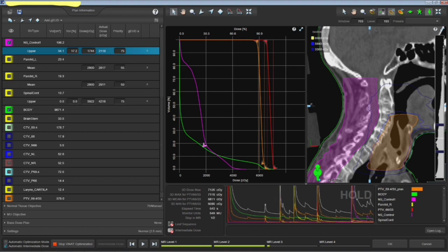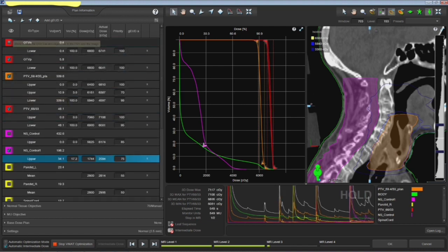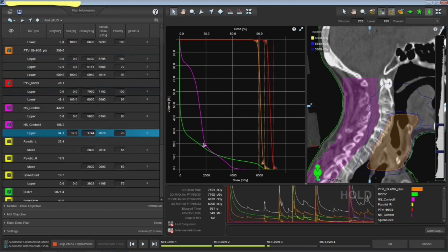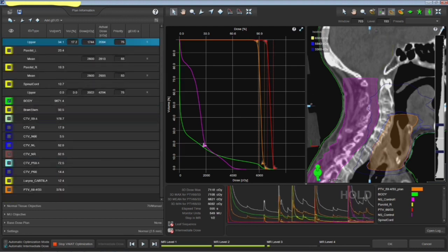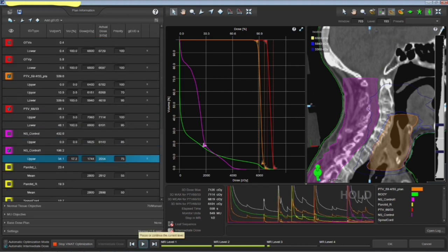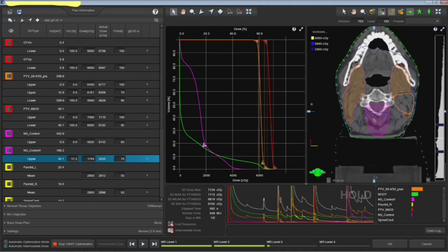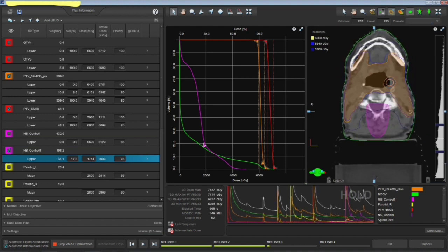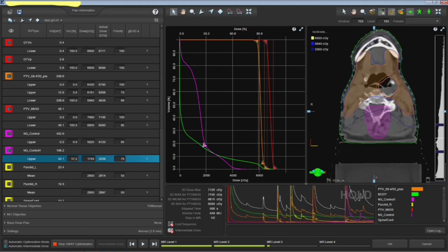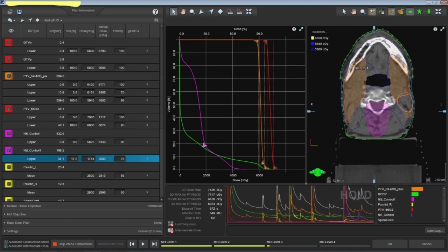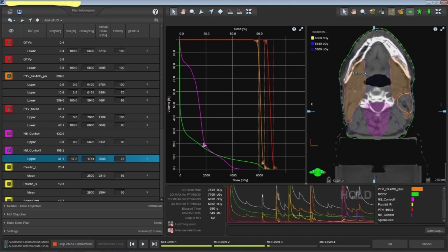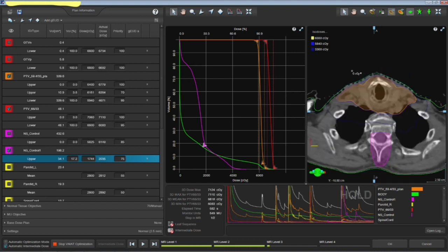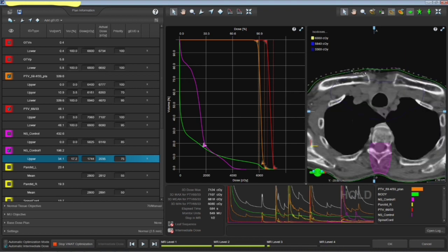Now it is in the third level. We'll definitely talk about what these levels are and what's happening inside later. And you should see that because of that control volume, dose reduction, what is the minimum dose of the target actually. Minimum dose is very important and where it is less, one should look into it and notify the clinicians. This is where the minimum dose is very less, are you okay with that?